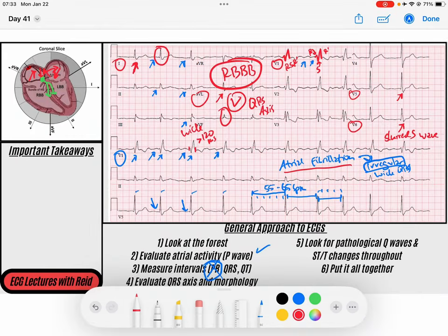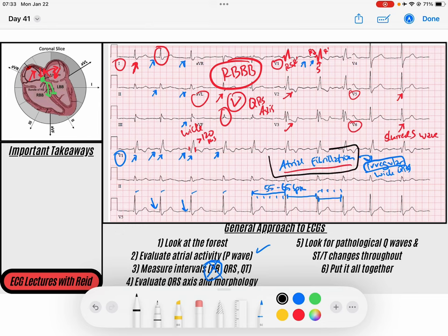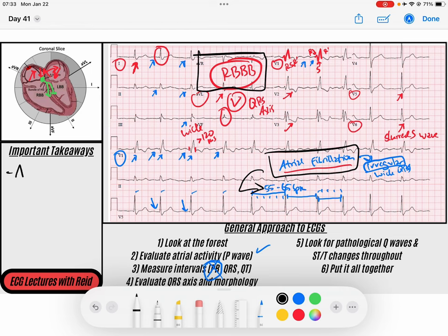I'm still not done. I'm going to take a look at my ST and T waves, and I see some strain patterns — typical T wave inversions on the right-sided chest leads capturing the right bundle branch block pattern. But that's normal for RBBB, and my ST segments are otherwise normal. So putting this all together, the diagnosis is atrial fibrillation with a normal ventricular response and a right bundle branch block.